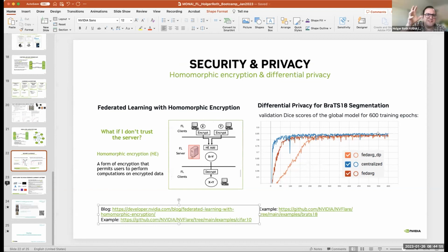Maybe one more thing is about the code security as well, right? Yeah. There are ways that you can make sure that only code that is authorized can run. I don't know if Chris is talking about this later, but we have some authorization protocols about who can run what type of task in this federated learning scenario. So all that kind of role assignment and security about the personnel having access to these systems also, of course, plays a role.